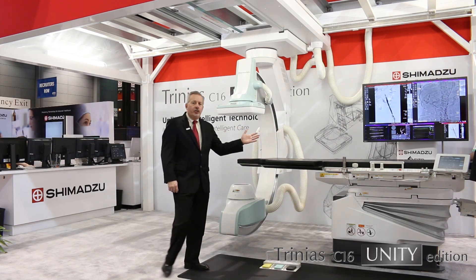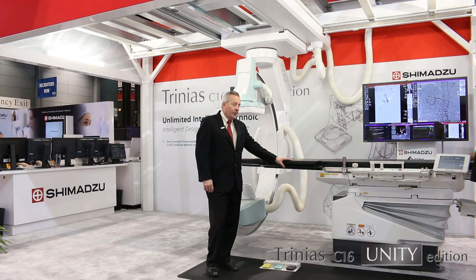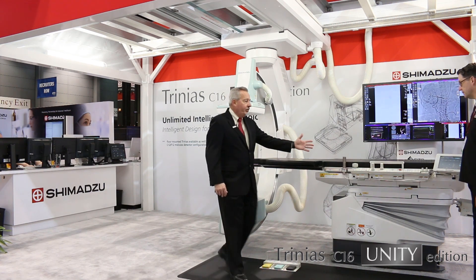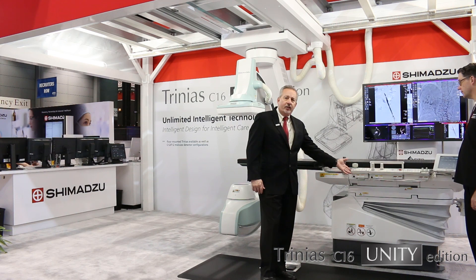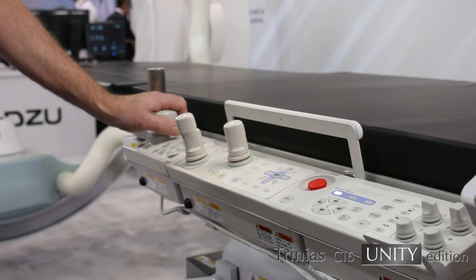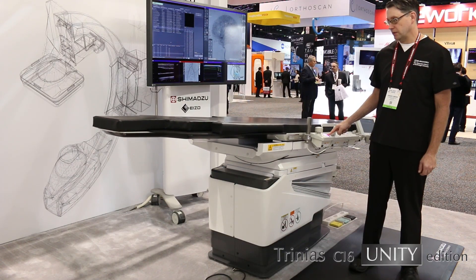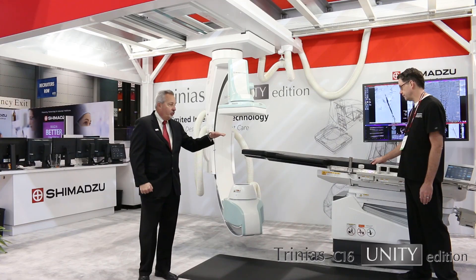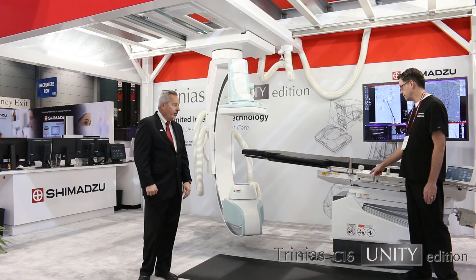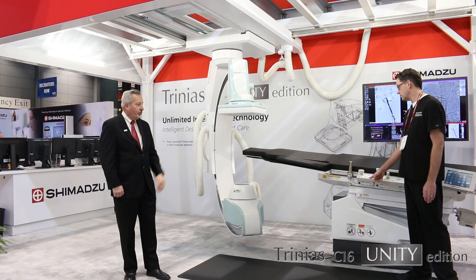The Trinius Unity Edition features the KS100 Smart Table. The Smart Table has a 550-pound weight capacity, and you can see the table side controls are easily accessible and easy to use. The Smart Table features tilt and cradle capability — Trendelenburg and reverse Trendelenburg, and then side to side, 15 degrees in each direction.